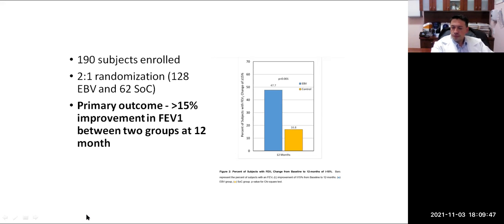I think it gives some of these patients a lot of options, but the real problem is patients who are excellent candidates but unfortunately don't have the fissure, and that is one of the biggest exclusion criteria that I'm seeing now, and we don't have an option right now for those patients.